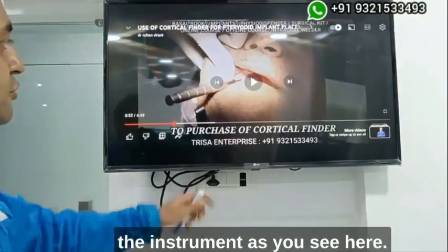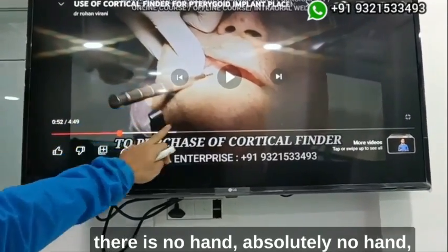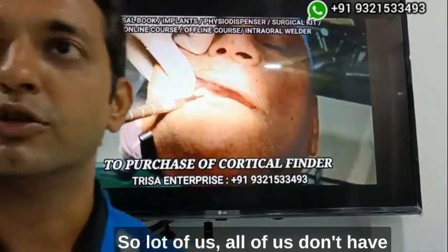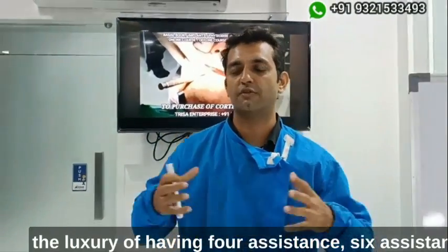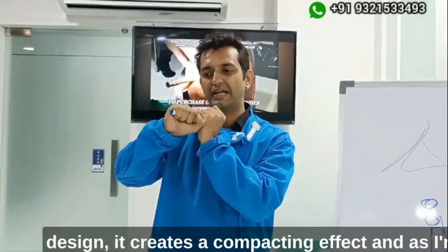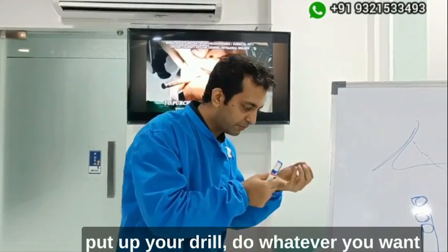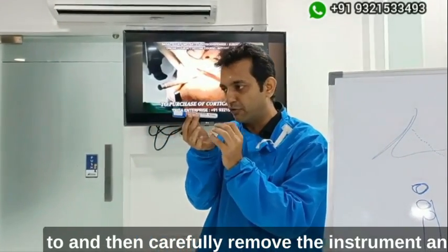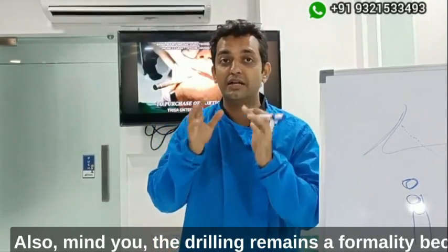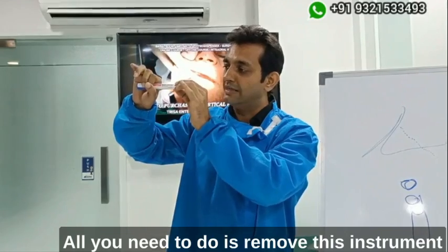Here is the beauty of the instrument — just observe carefully: there is absolutely no hand holding the instrument. Many of us don't have the luxury of four or six assistants, but because of this design's compacting effect, it holds in the bone. It becomes very easy for you to step away, set up your drill, and then carefully remove the instrument and introduce your drill inside the same osteotomy.